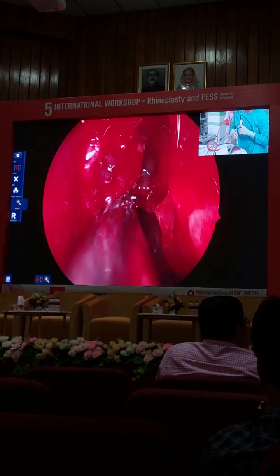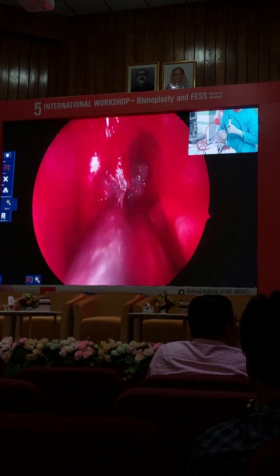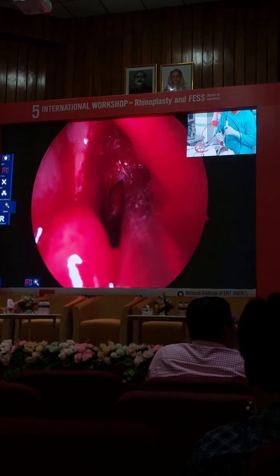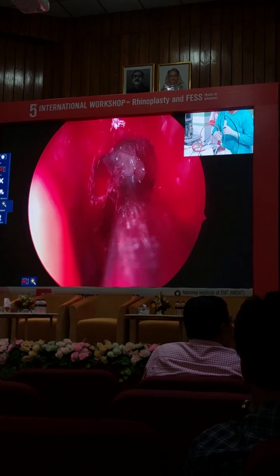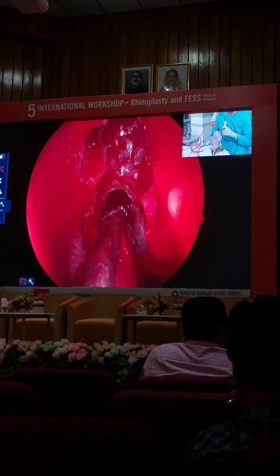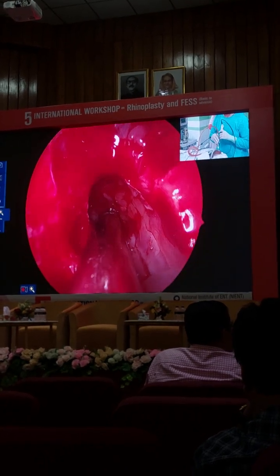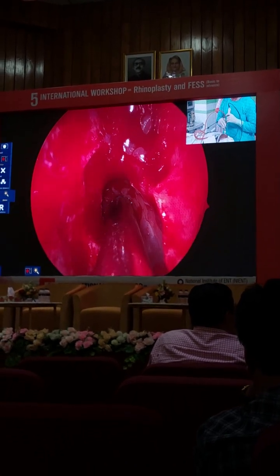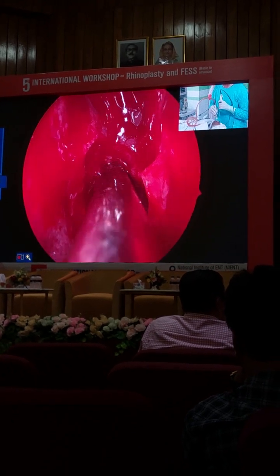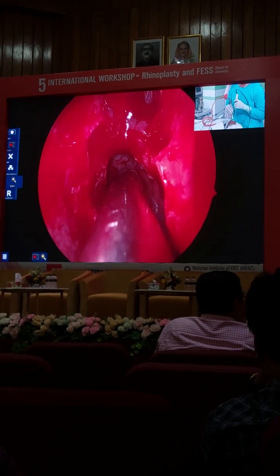Okay, and then from posteriorly we are going to go superiorly towards the skull base. Where is the skull base? How do I know? I know the skull base will slope superior to inferior as we go from anterior to posterior. Correct? So now I want to check. Do I need, is this skull base already or not? Correct? At the back.